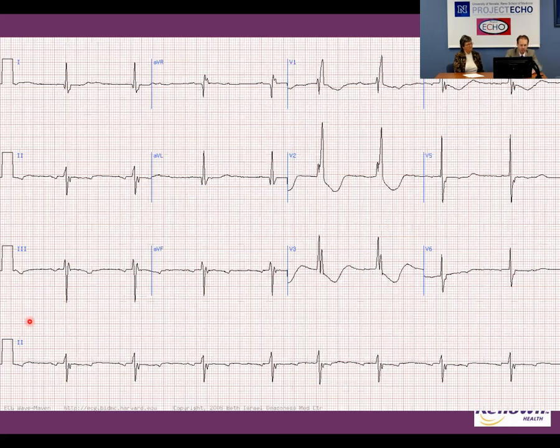So then you say, okay, this is some sort of atrial activity. You march it, and you see that those P waves actually march. This is then an ectopic atrial rhythm, almost borderline ectopic atrial tachycardia. The rate of the atria is about 96. So this is just to highlight that if this atrial rate were a little faster, it'd be atrial tachycardia.